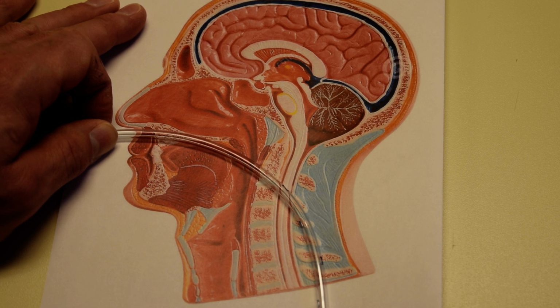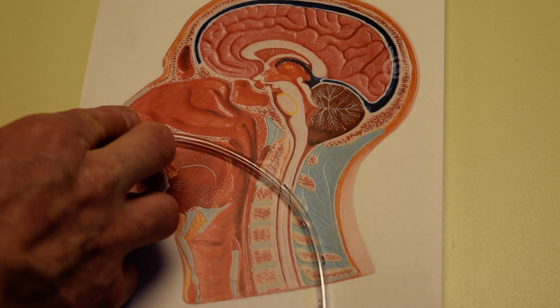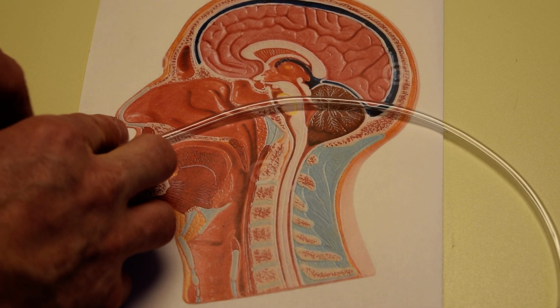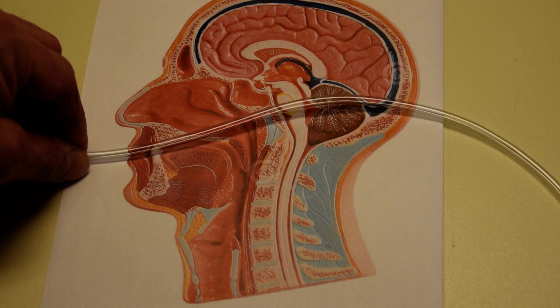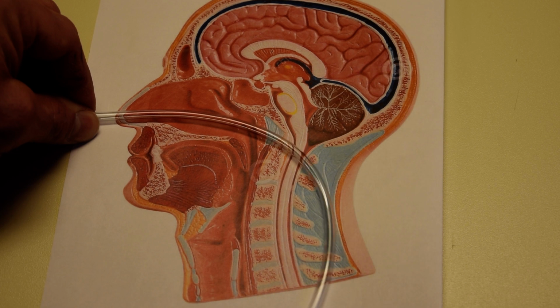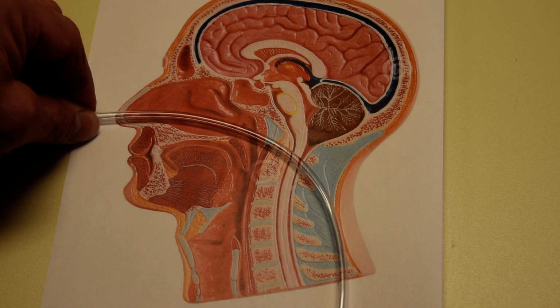If you notice that your patient is gagging and not tolerating things as well, but they're not choking, at this point, you may choose to go a little quicker if you're confident that you're going down the esophagus and get to the point where you have determined the depth of your insertion.